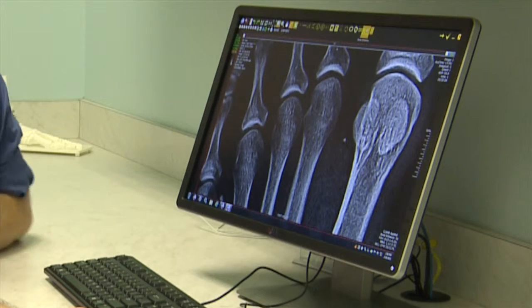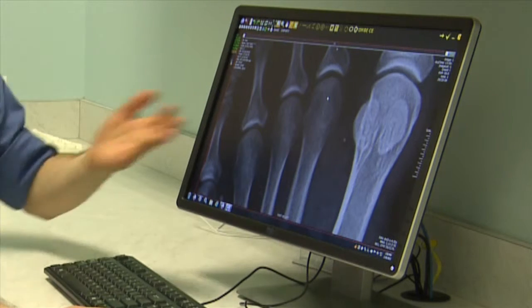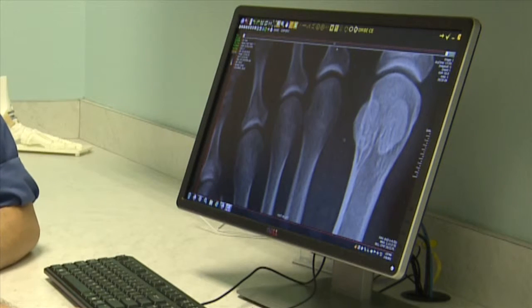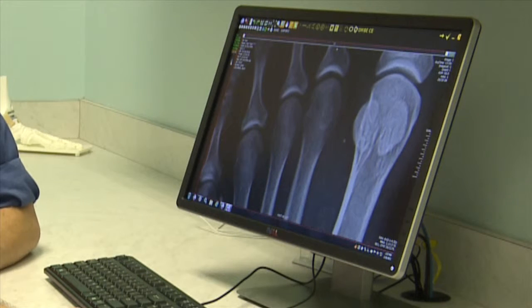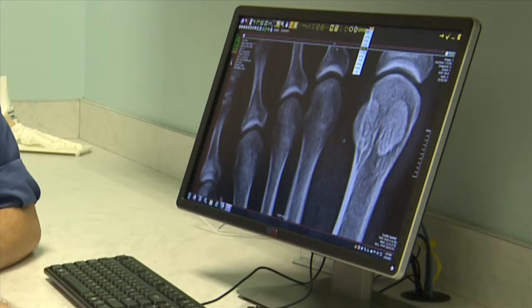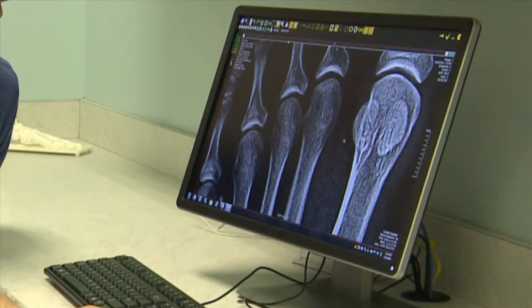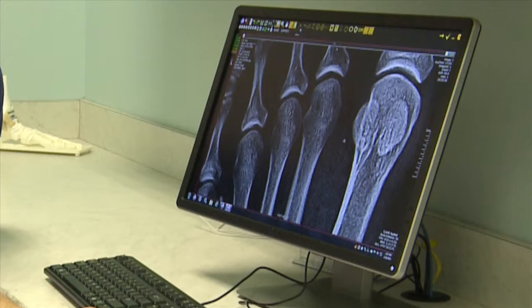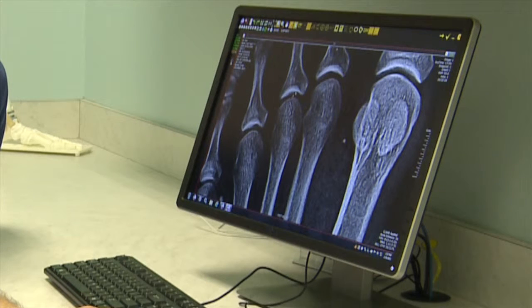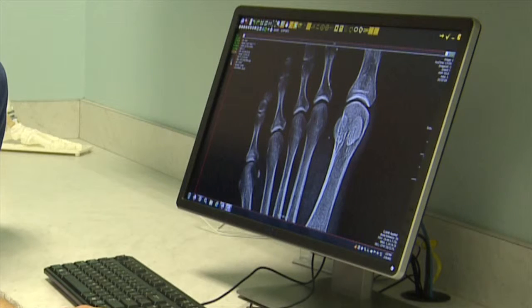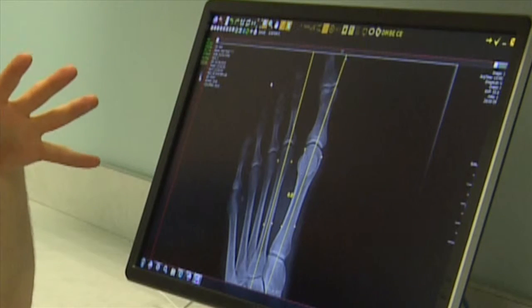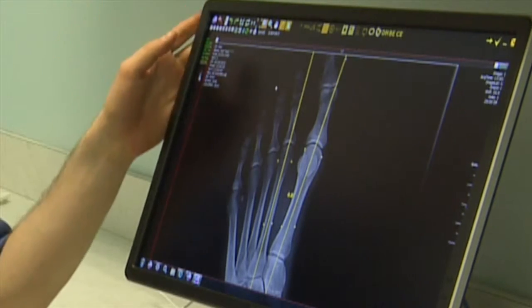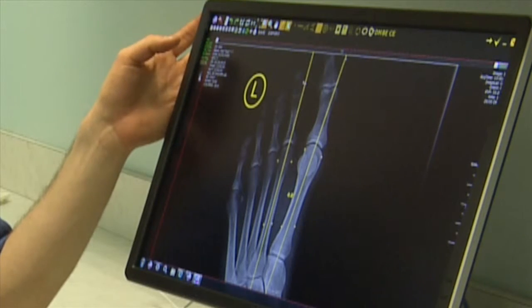Reset the image here so you can see the difference between a normal view and an enhanced one — once you get really zoomed in, it's helpful to enhance further. Some basic annotations are up here: arrow and measurement, which is a simple measurement tool. Up at the top you also have your markers — you can add markers while the technician is taking x-rays, or add them afterward in the viewer.